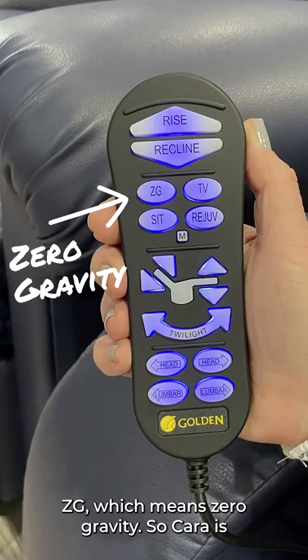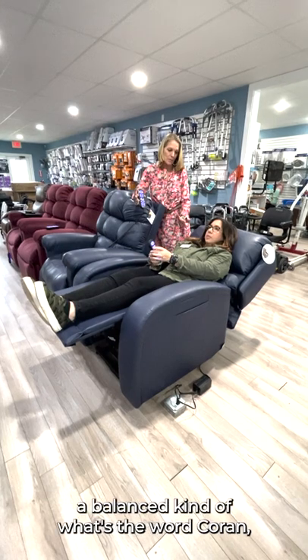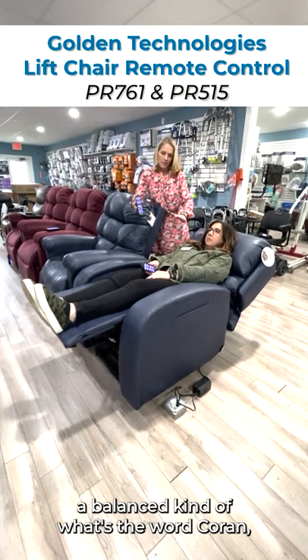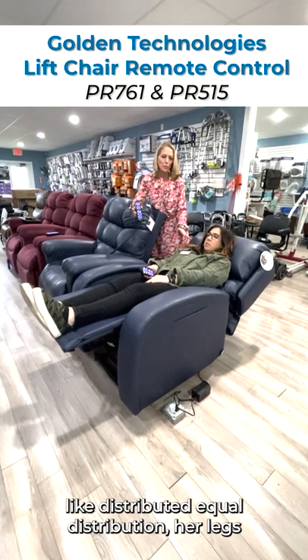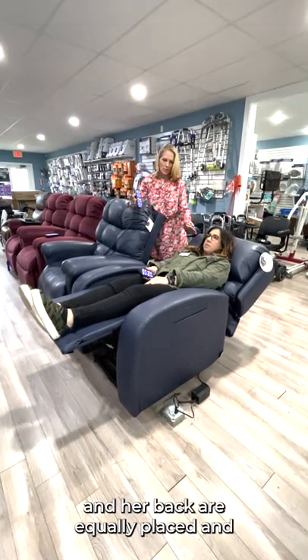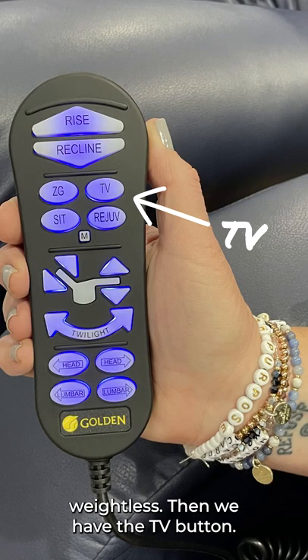We have the ZG, which means zero gravity. So Kara's going to go into this zero gravity, which is a balanced — equal distribution. Her legs and her back are equally placed and weightless.